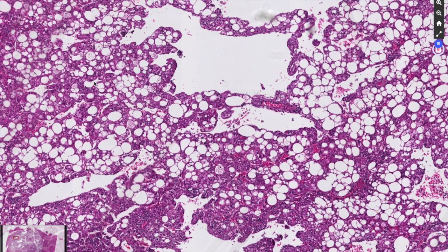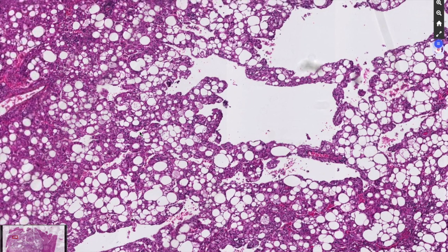So this is really an important point of this seminar. When you have a tumor that looks hepatocytic, remember and don't hesitate to perform immunohistochemical markers of hepatocytic lineage.